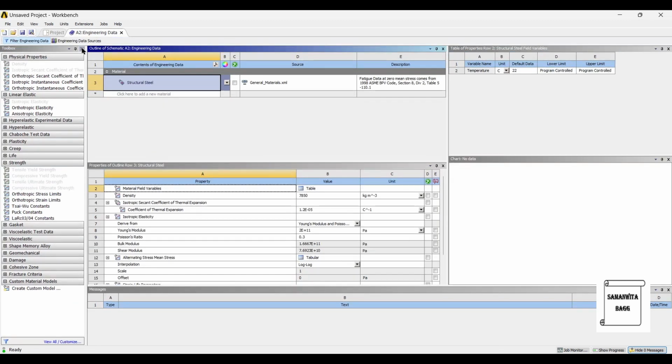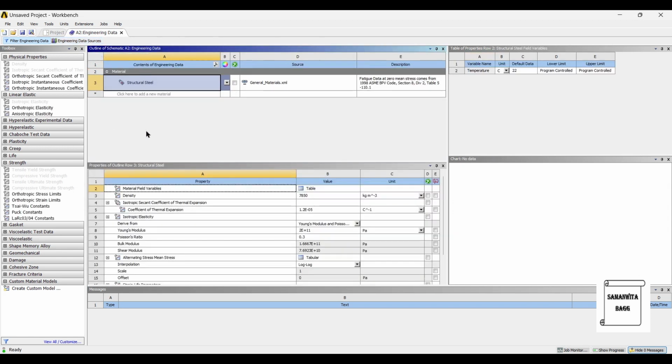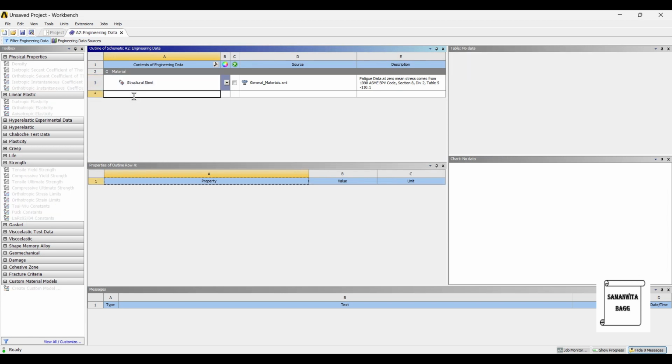Now, in this version that I am using, 18.1, the material that I am going to use for the analysis, that is stainless steel 316, this grade is not available. So I will have to create the material and then use it. If you use the latest version, then in ANSYS Granta materials, like I showed you in the previous video, you will find the material of 316 stainless steel. So since I don't have it in this version of ANSYS, I just create the material.